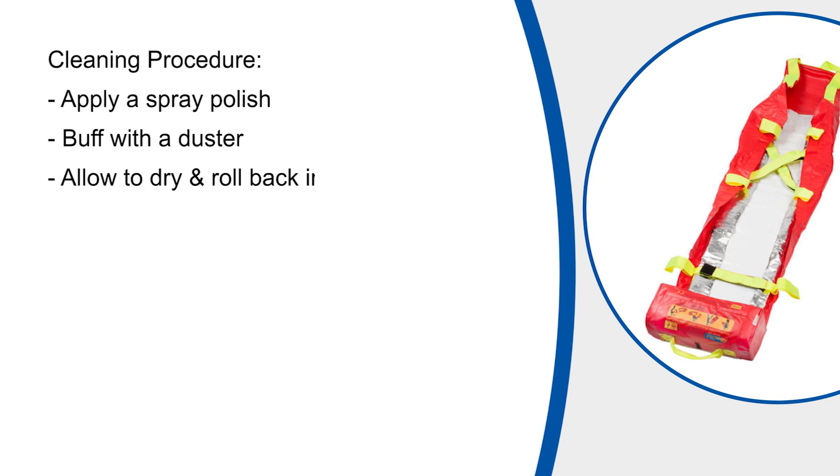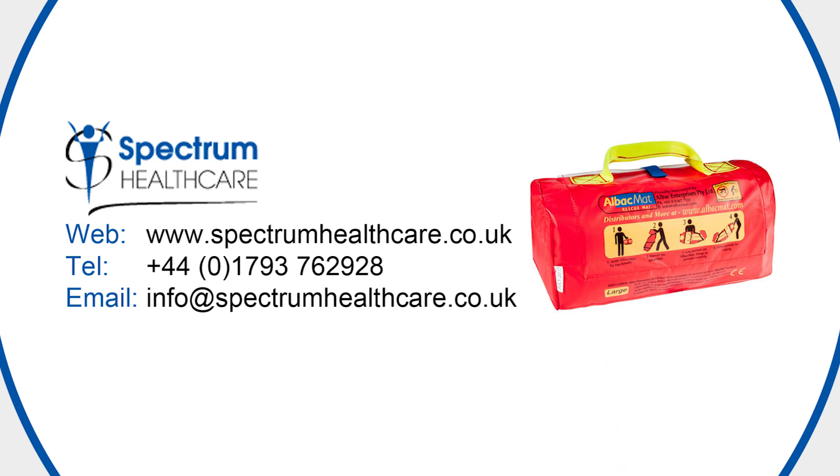Where a mat has been used for training purposes, the base can be cleaned by applying spray polish and buffing with a duster or cloth. Ensuring the mat is completely dry, it is simply folded and rolled back into the foot pocket. The base can also be cleaned using antibacterial wipes. If you have any questions or would like to request more information on the ALBAC mat, please contact Spectrum Healthcare.